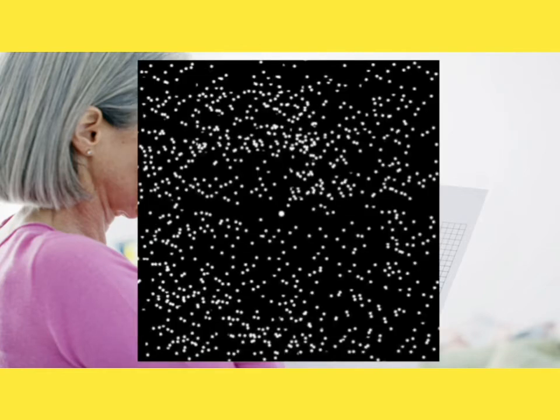Okay, now let's move to another. Here you can see there are no horizontal and vertical lines, only many dots. So what is the purpose of this card? This card is used to detect only scotoma, not micropsia or macropsia of the lines. So it is only used to detect the missing of any area.